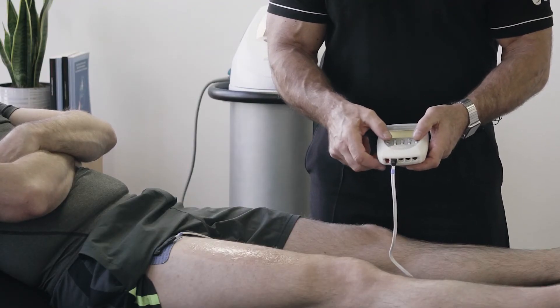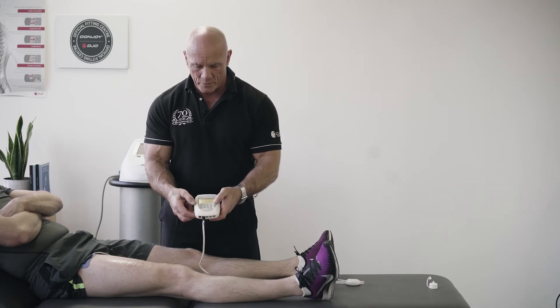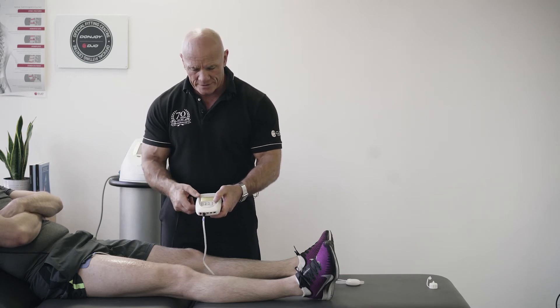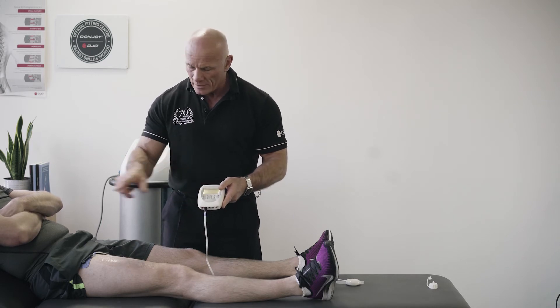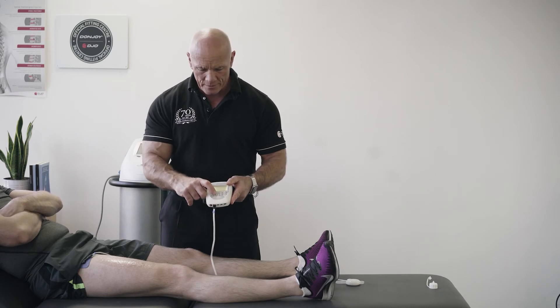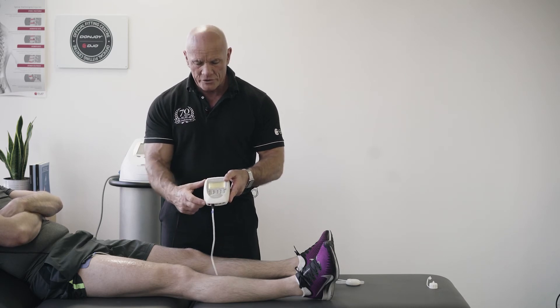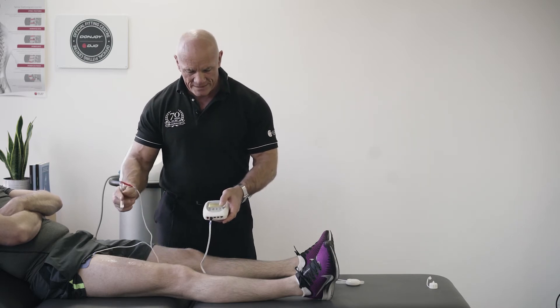We go into our program and find a program called motor point — a specific frequency for finding the motor point. We enter, and we have a body chart because the pulse width varies around your body, so we choose the correct area with the correct pulse width, then press enter.